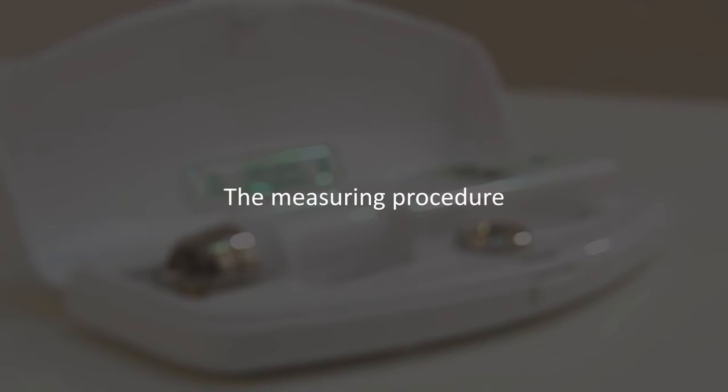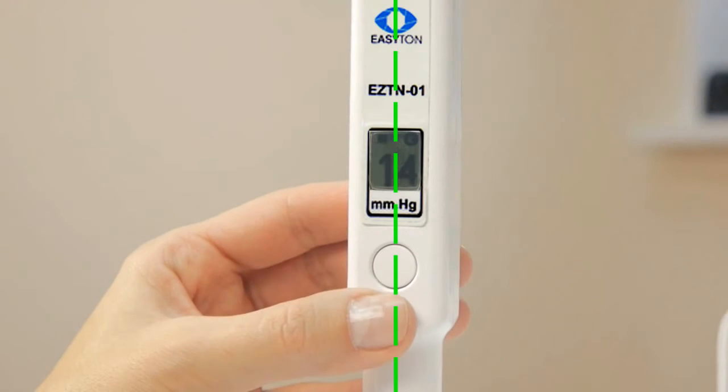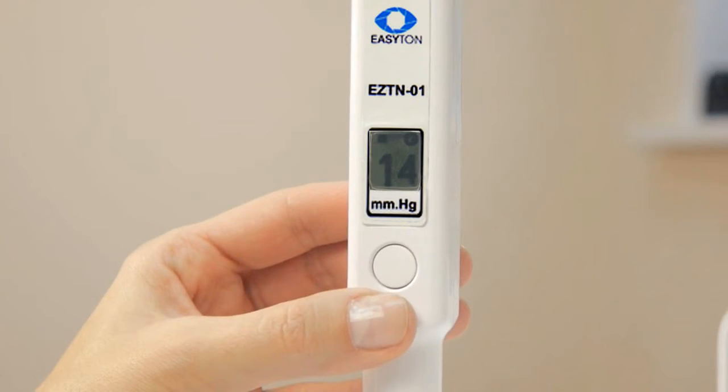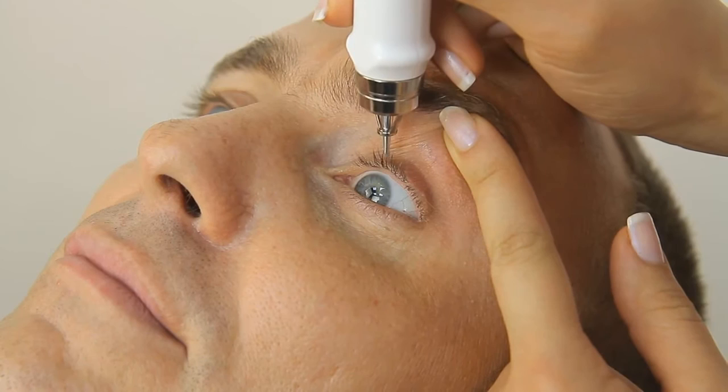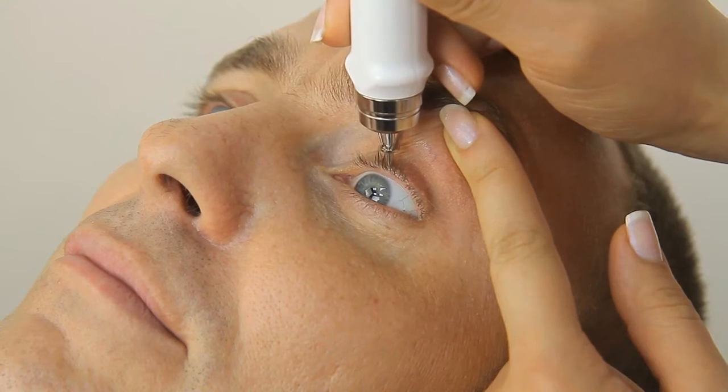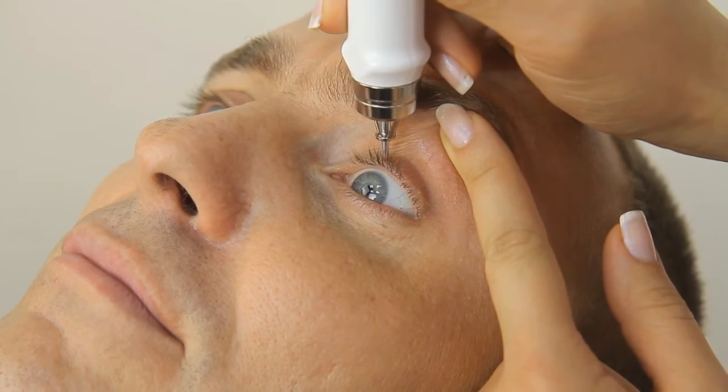The measuring procedure. Place the tonometer vertically down. Gently lower it by 2 or 3 millimeters until it makes a single beep. Do not push the device down too hard. The protective ring should be 2 to 3 millimeters above the eyelid surface while measuring.